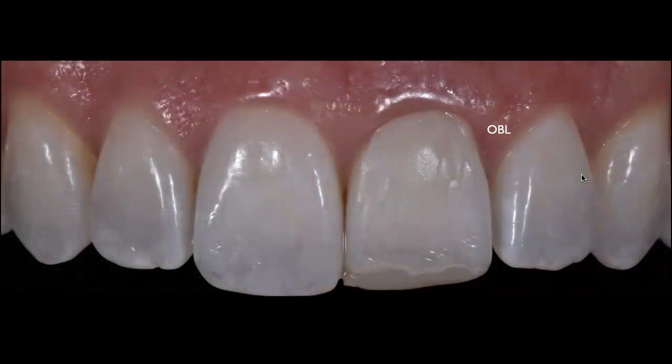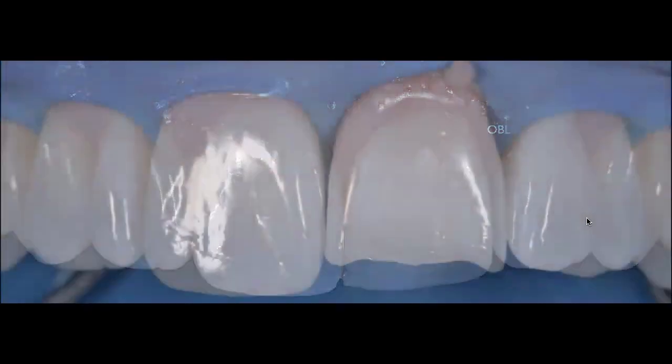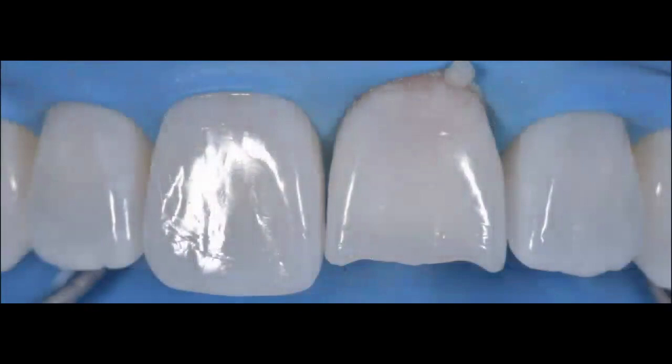So here I'm trying that OBL. Again, I'm just trying to make sure, is it enough opacity for this material in order for me to recreate that opaque area that I need on the cervical third? The answer to that question was no. So I decided to actually add underneath the OBL a very thin layer of an opaque resin, again made part of that Mirrors 2 kit made by Coltene.